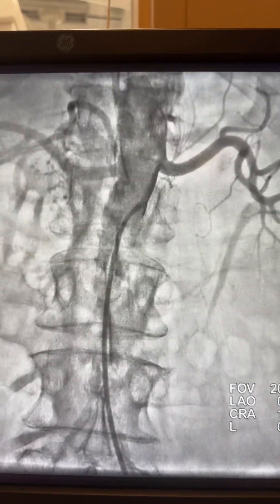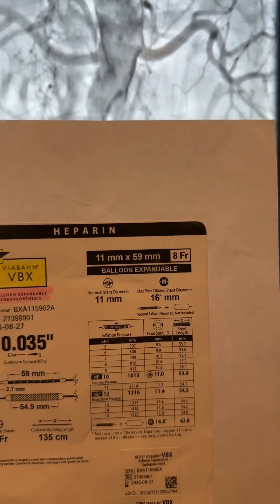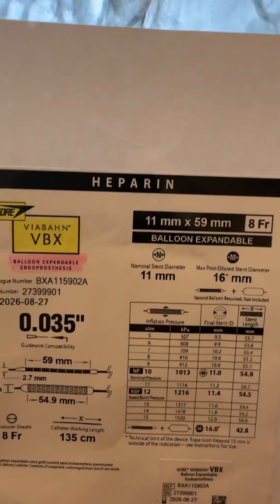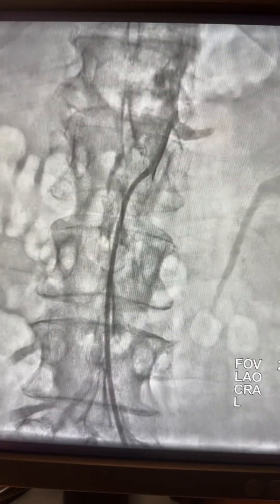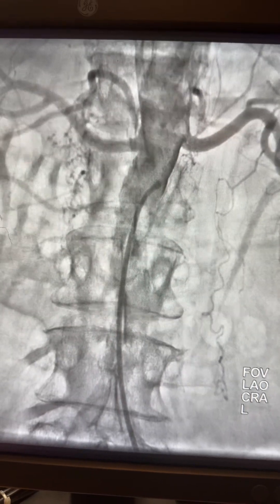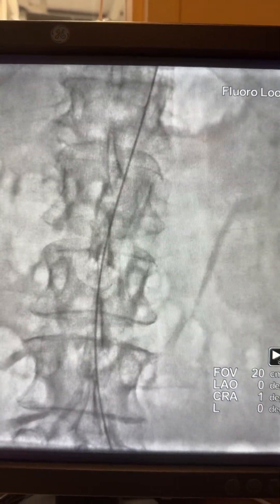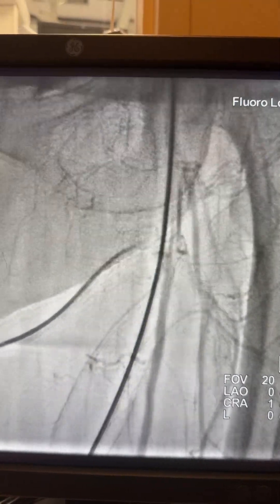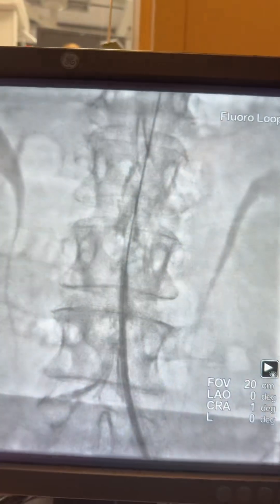You can tell where we're going to place this stent. I'm going to use the Gore 11 millimeter by 59 millimeter balloon-expandable stent, which goes over a 0.035 wire. So I have to upgrade the sheath to an 8 French sheath. I change the wire to a long J-wire, pull the sheath, and do an angiogram to make sure the vessel can handle the 8 French sheath, then upgrade accordingly.